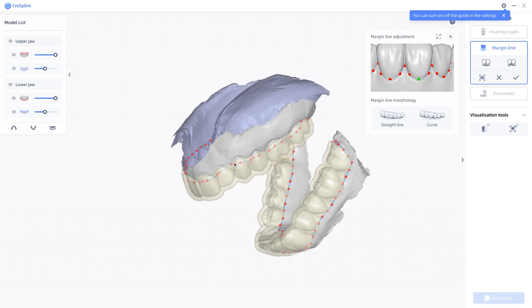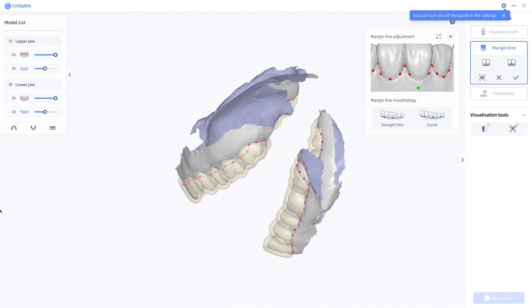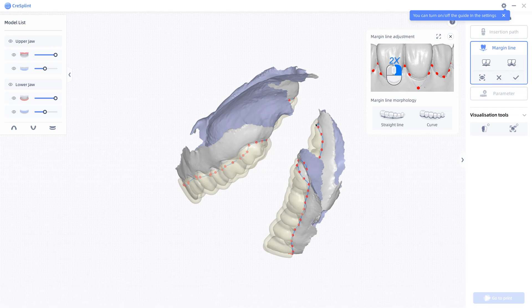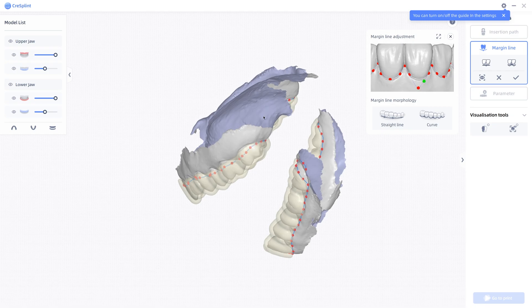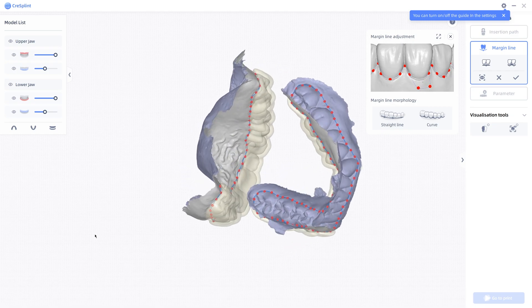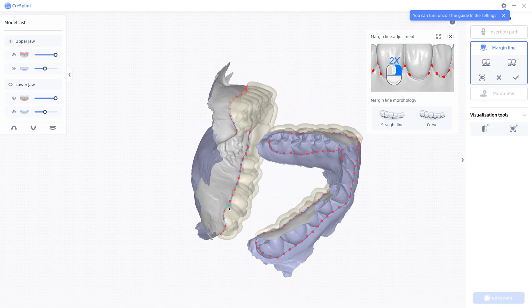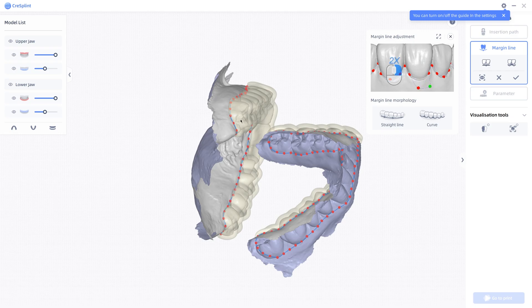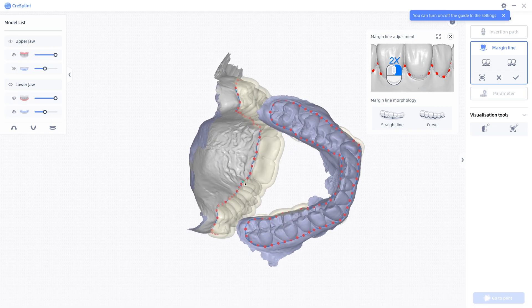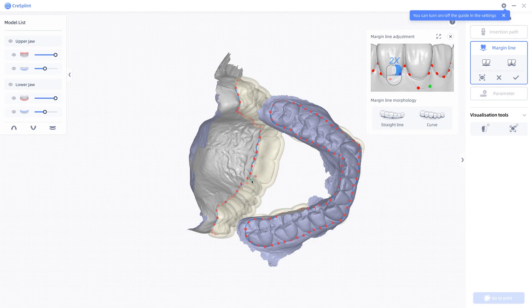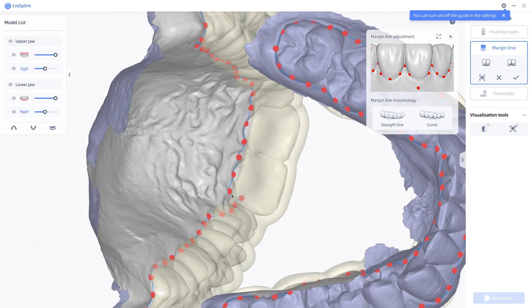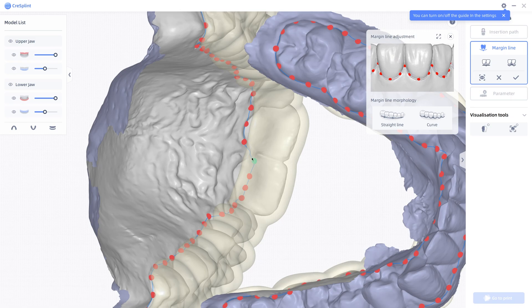I find this a little tedious. I wish it would just let me generate the margin line myself from the beginning. It likes to put it right down on gingiva. Some people do not like that. Like some people, specifically like here. If you don't want it making contact with the palate.